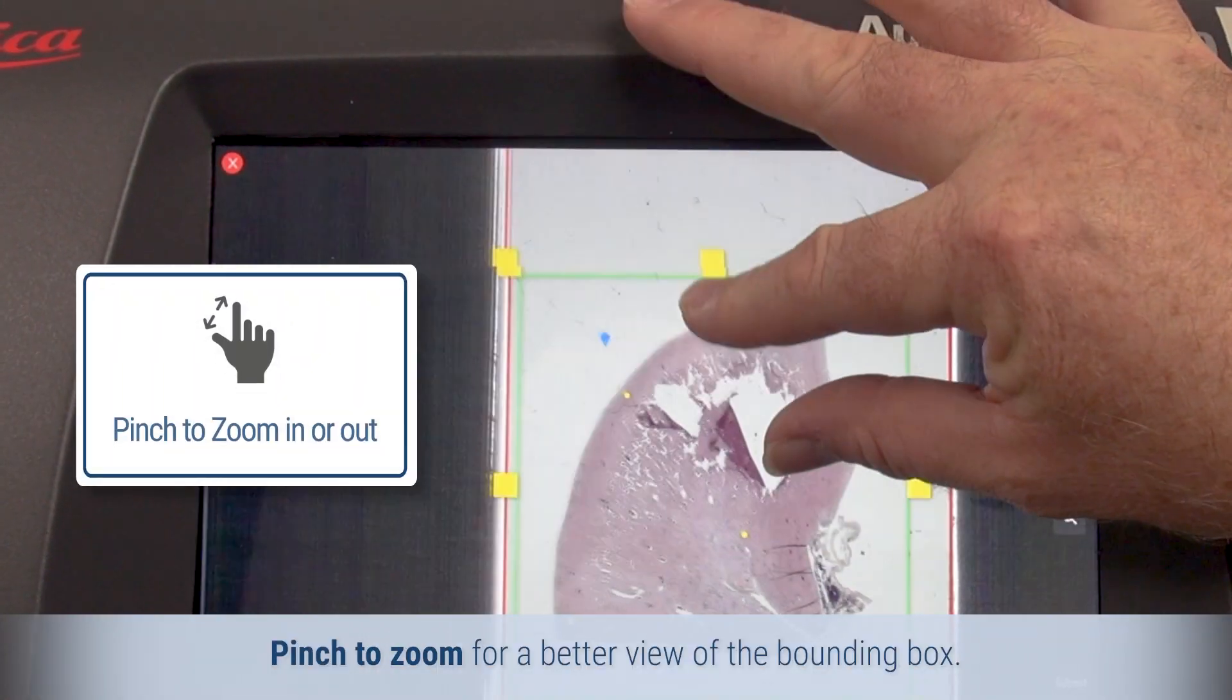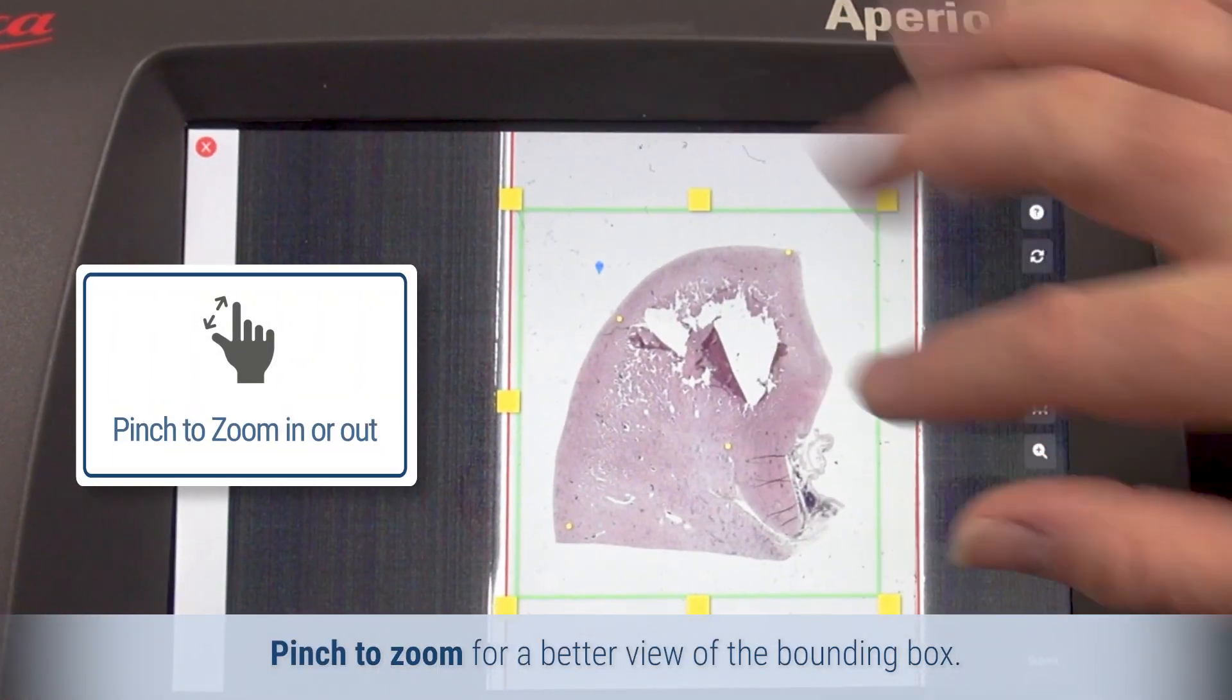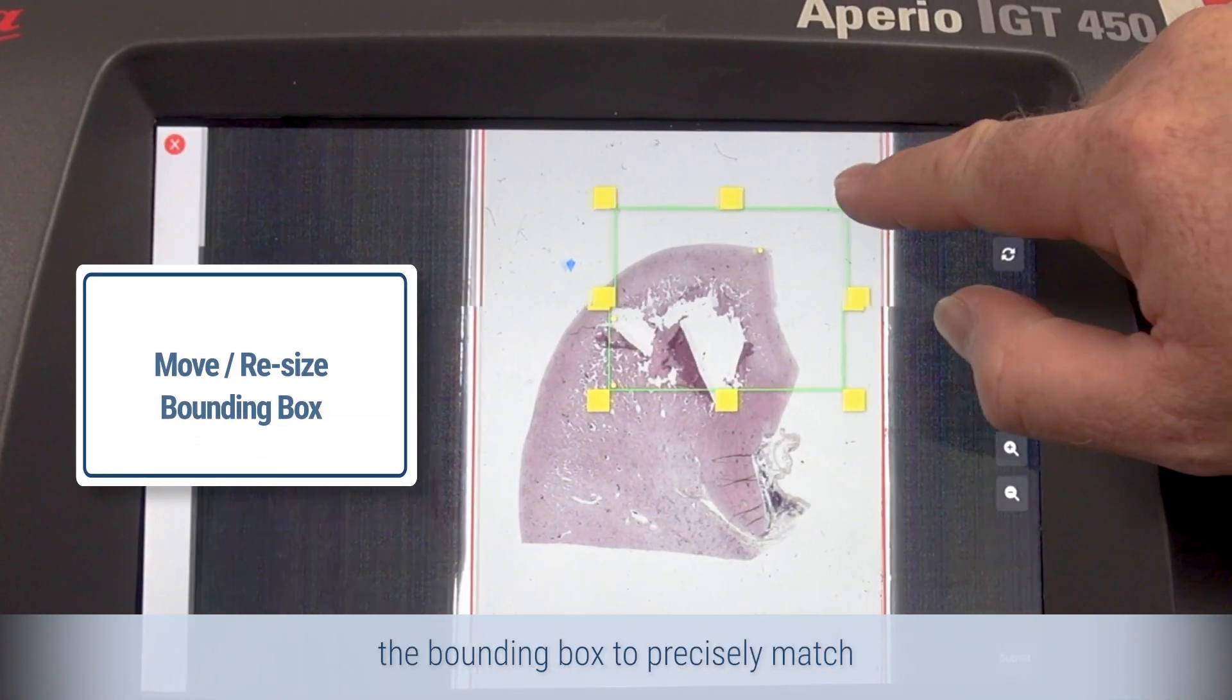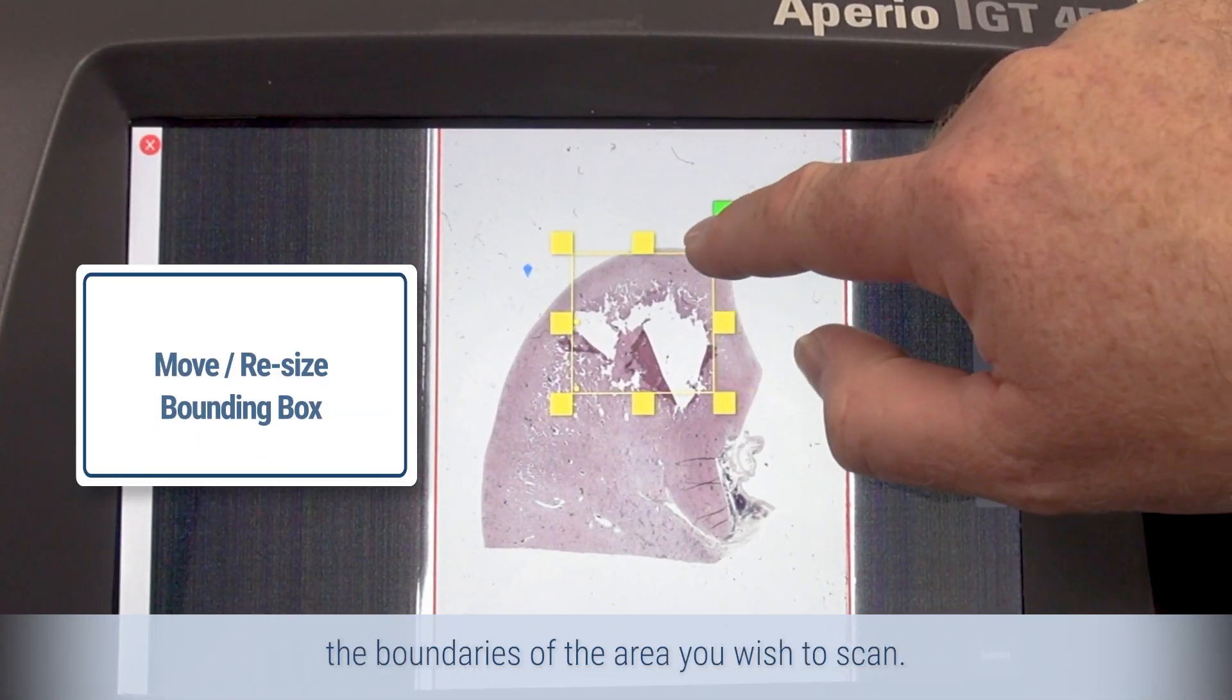Pinch to zoom for a better view of the bounding box. And drag to move or resize the bounding box to precisely match the boundaries of the area you wish to scan.